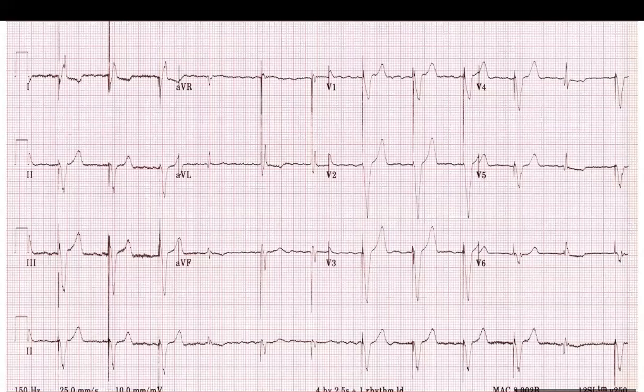So when part of the myocardium captures from the pacing, it will fuse with the electrical signal that is also generated from the native QRS. That's why it gives you two different morphologies. So it's not similar to the native because the myocardium activation has a different pathway, and it's not totally paced because the pace also has a different electrical pathway to go through the myocardium. So that's why it gives you a fusion between the native and the pacer morphology. Did you understand or not?